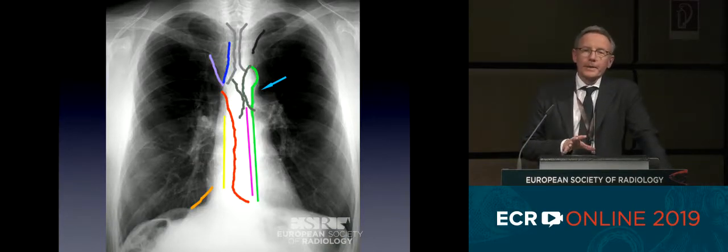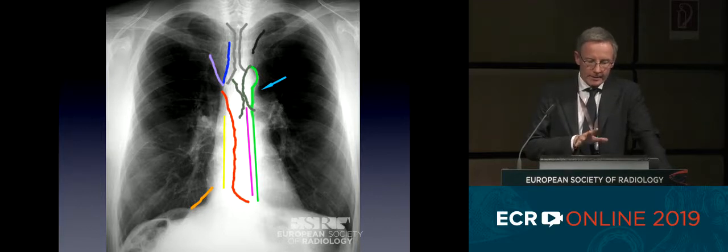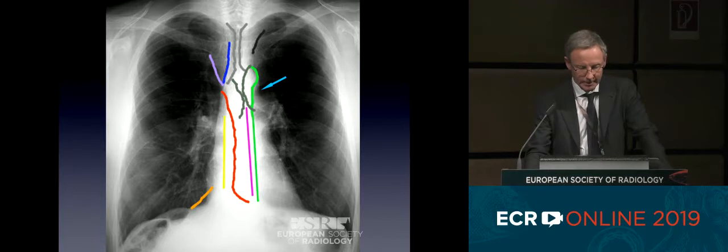There are plenty of mediastinal lines which we were taught as younger radiologists to recognize. Now these are a little bit forgotten because we use cross-sectional imaging. I've drawn these colored lines on a radiograph here. These will be explained to you in much better and greater detail by Marielena in the talk on the mediastinum.